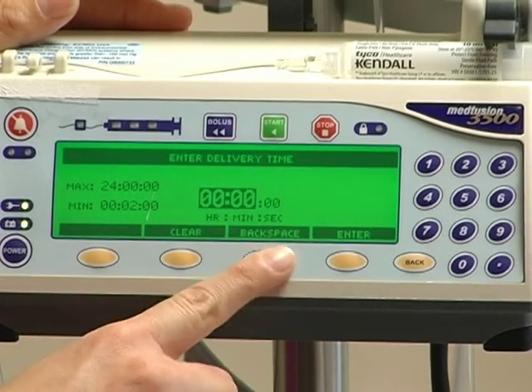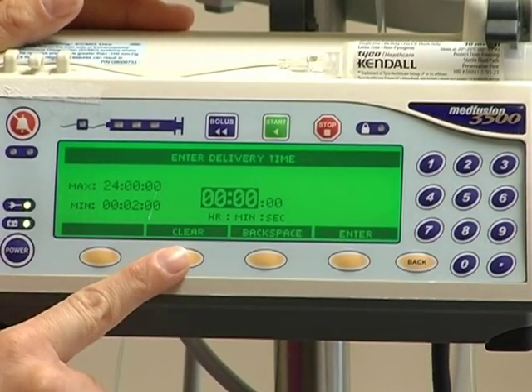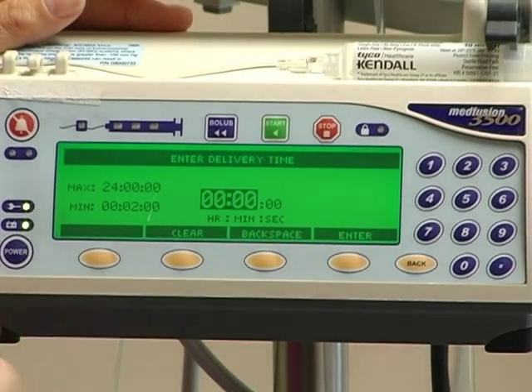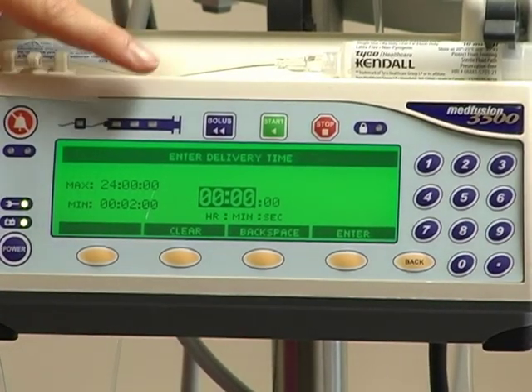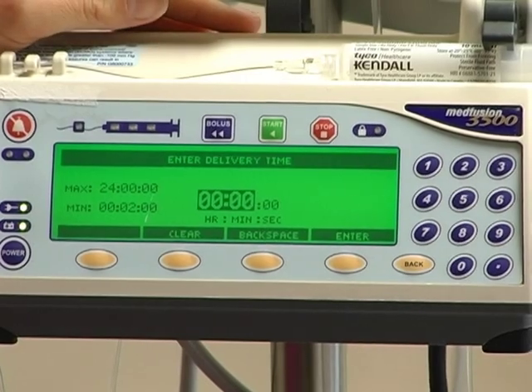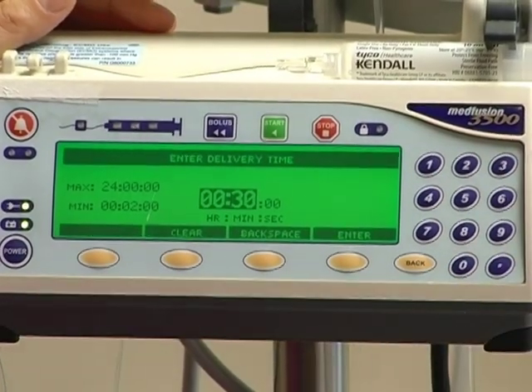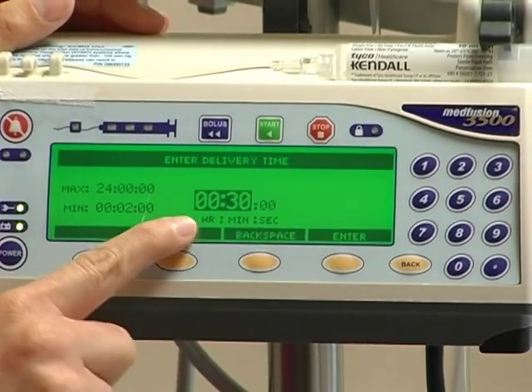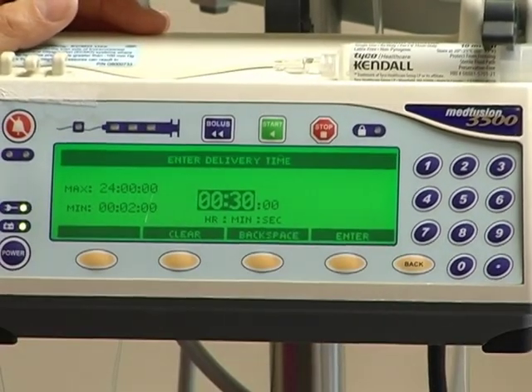On every screen you'll have three options at the bottom: an option to clear, an option to backspace if you made a mistake, and then of course your enter button. The fourth screen is your delivery time — for example, 30 minutes. It reads in hours, minutes, and seconds, and that is displayed on the bottom there. And again you'll just press enter.